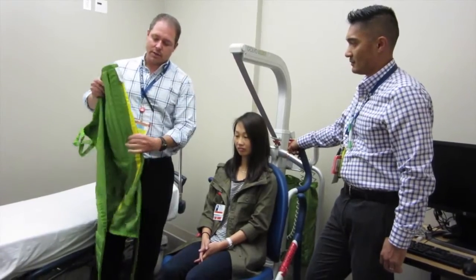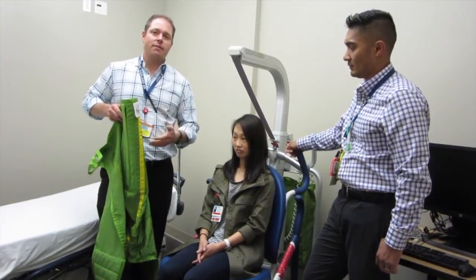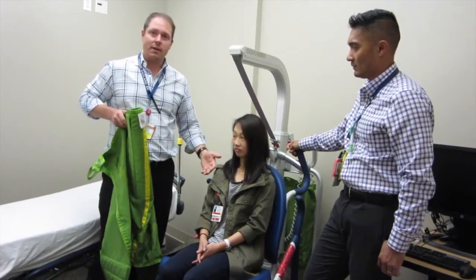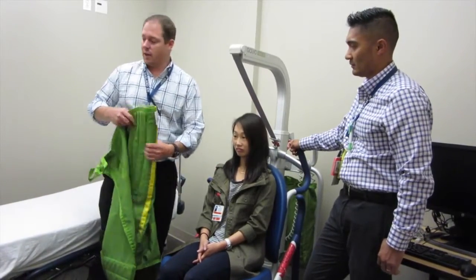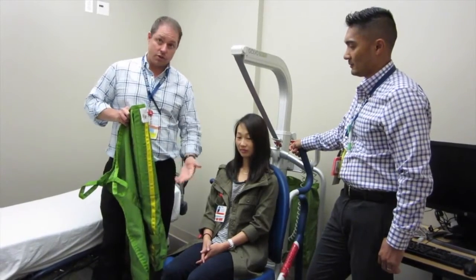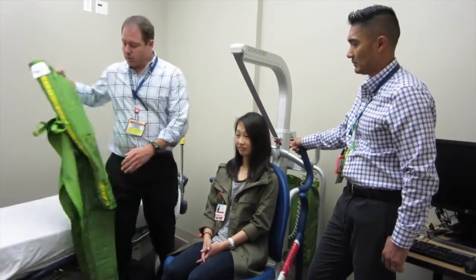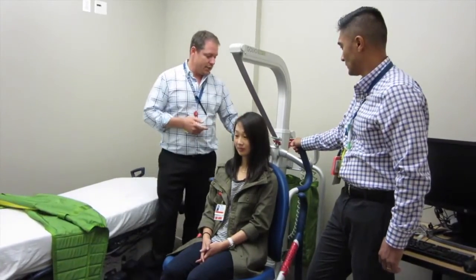What we do notice with the different sling sizes is the more you match the patient with a sling size, the higher up you'll ultimately sit. If you use an extra large sling on somebody petite like Christine, they're going to sit really low in it and they're going to be scraping over the gurney. So ideally, medium with a medium is going to be better because she'll sit higher in it. There's less material.